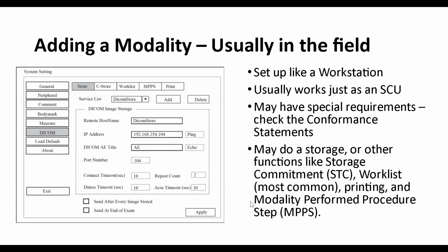I want to say this is a screenshot that I took from an ultrasound user manual. I want to say Acuson. This is what their menu looks like. See commonalities? The three big settings: AE, IP, port. This is for the image storage. If you look up somewhere on there, you will see its settings, but this is so that it will talk to an archive. So this is where I might put PACS, right?